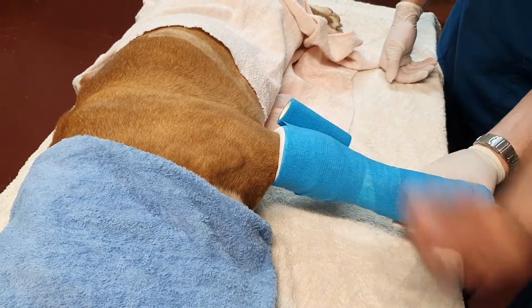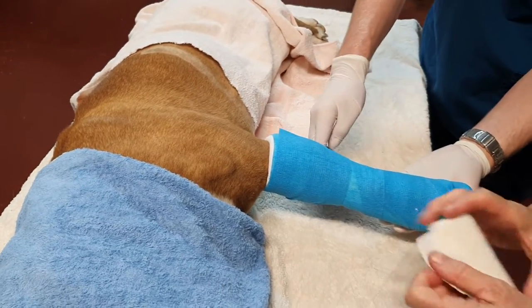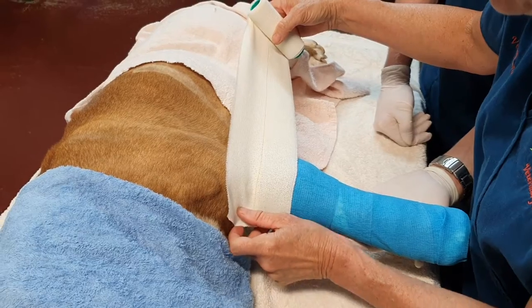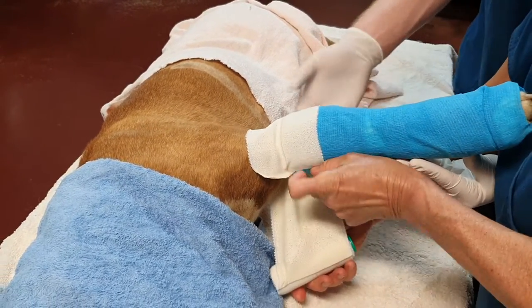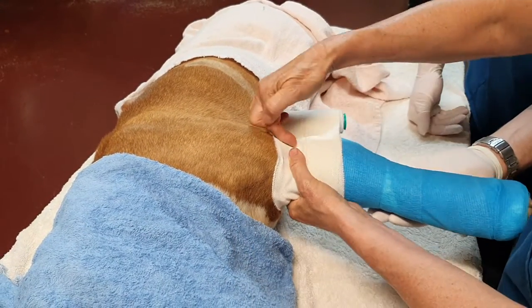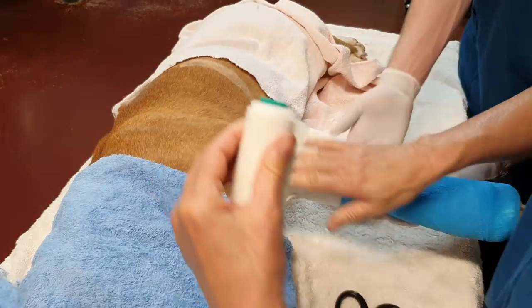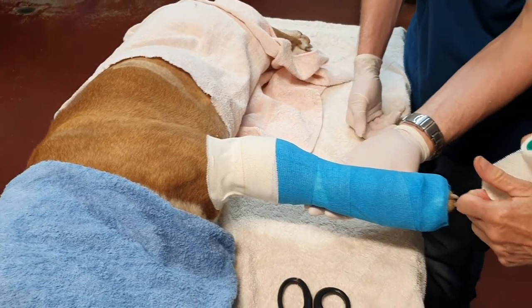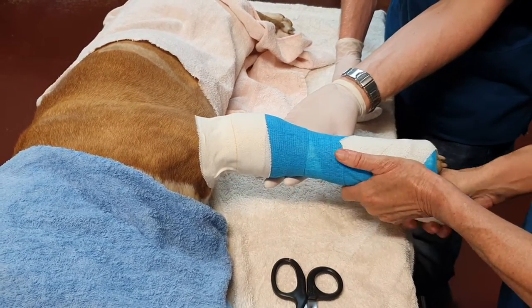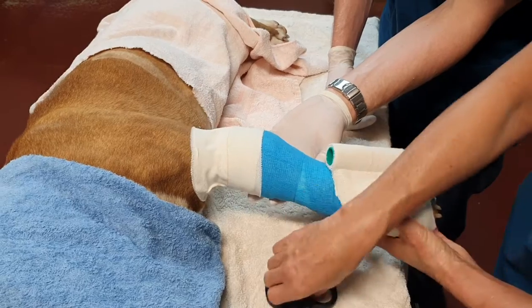So that's just one tertiary layer. I put one row of elastoplast so it's half on the splint, half on the dog. That's just to try and stick the cast to the top of the leg, but also helps to stop crud, dirt, or whatever else dogs get into ending up down inside the splint or cast. Down the bottom I'll sometimes put another layer just for a bit more durability. You may well ask why I didn't just do the whole thing in elastoplast — and there's absolutely nothing wrong with doing that if you prefer.